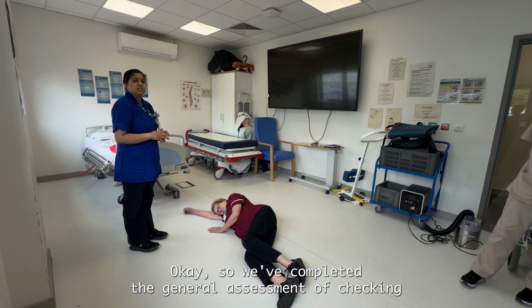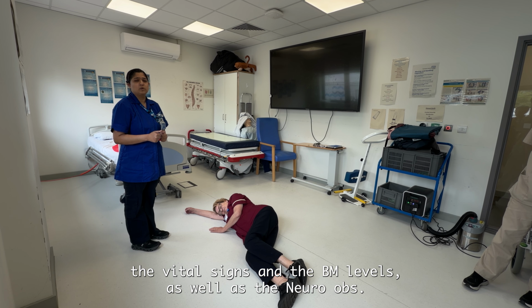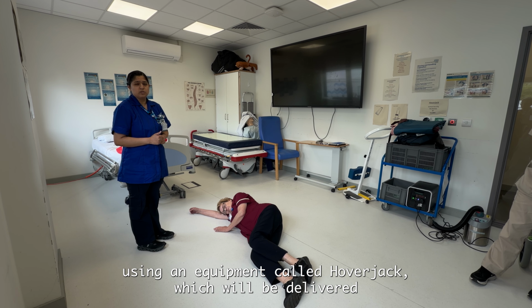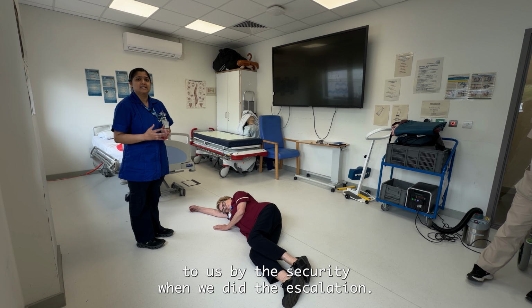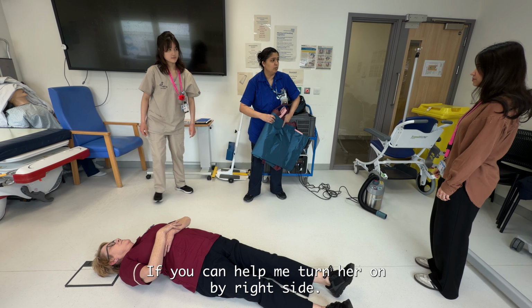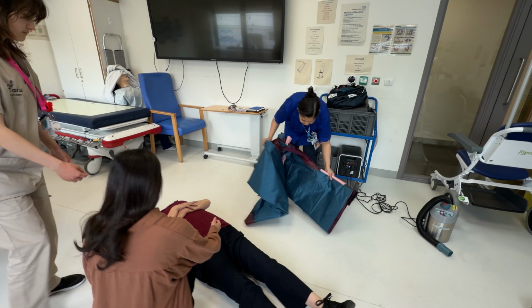So we've completed the general assessment of checking the vital signs and the BM levels as well as the neuro-obs. We are going to get the patient back in the bed using an equipment called Hoverjack, which will be delivered to us by the security when we did the escalation. So I'm going to use the sliding sheet. If you can help me turn her on her right side, we can put this back in the bed.